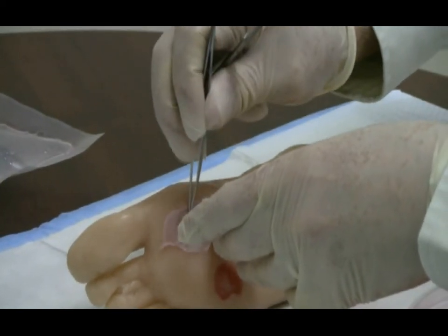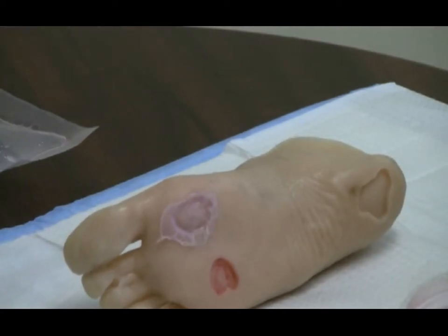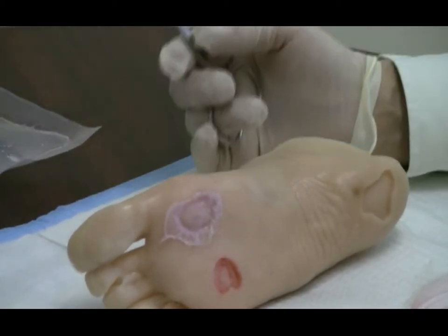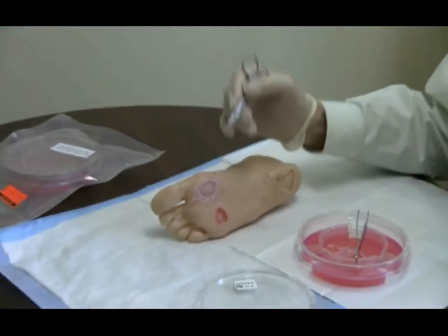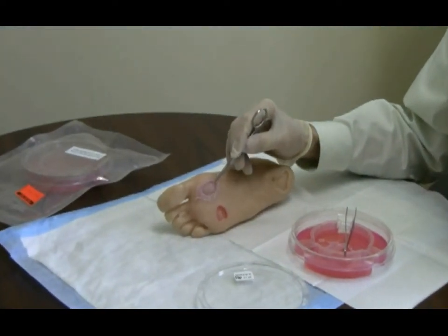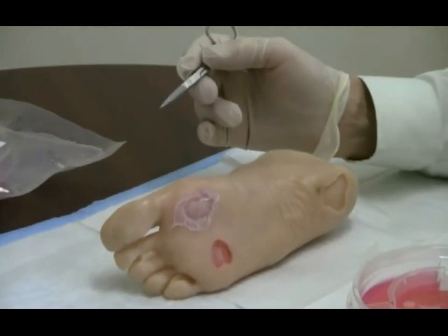Change the dressing at the end of about two weeks, and we can show that these ulcers will heal more readily with the Aplograph. We can apply up to five applications. Usually though, the wound will already be well advancing. It'll reach a tipping point and begin to heal as time goes on from cell signaling.